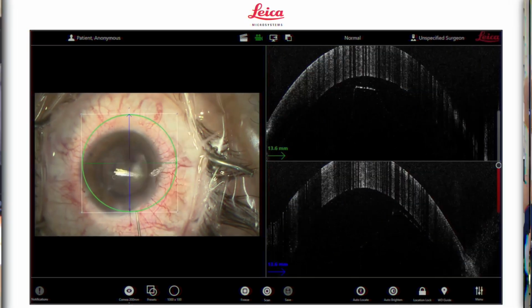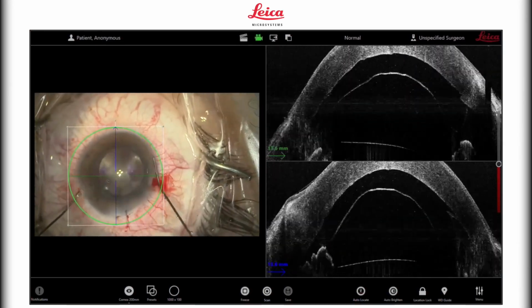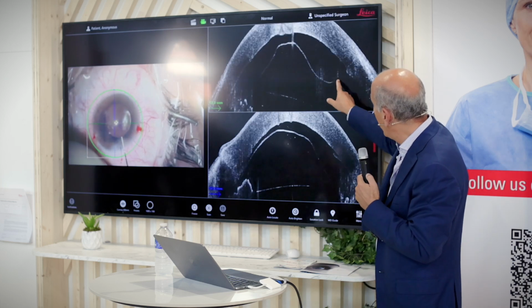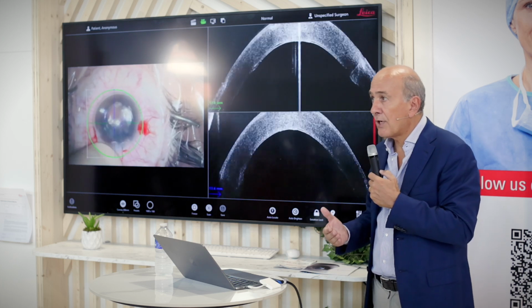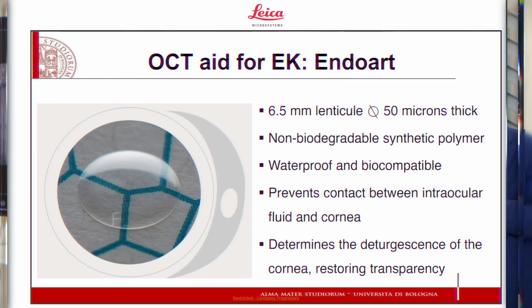And once it's actually unfolded, then you're sure that you can inject air or gas as you prefer in order to achieve the best result. So here you can see the coiling, which is actually facing upward, okay? And you know 100% that the orientation of the donor is correct.